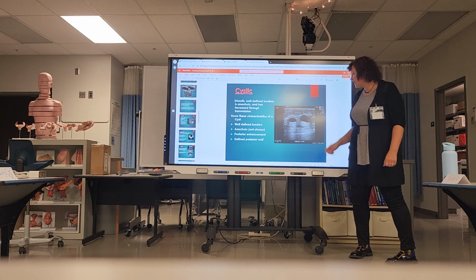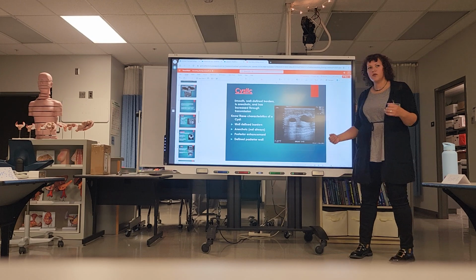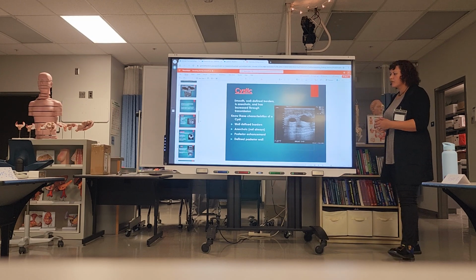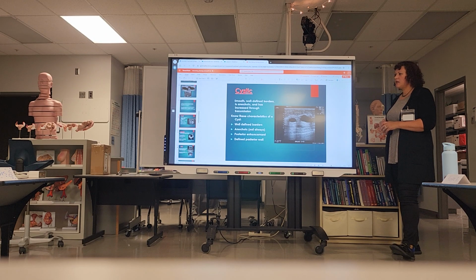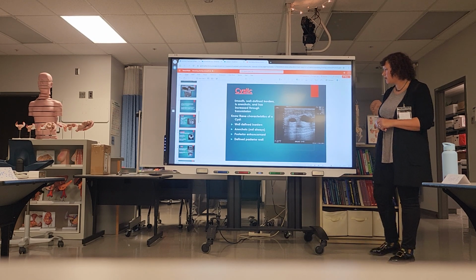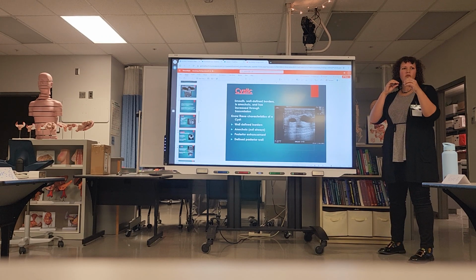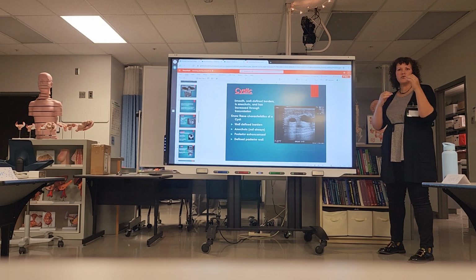Sometimes a cyst can have echoes in it, such as a gallbladder. If somebody hasn't eaten for a long time, they can get something in there called sludge, and that will appear as echogenic material in the gallbladder.